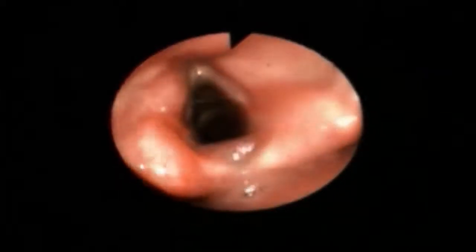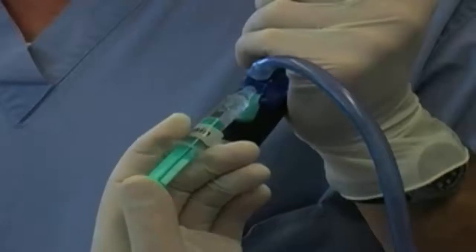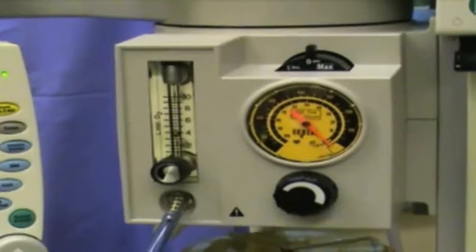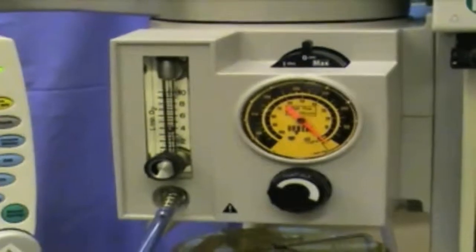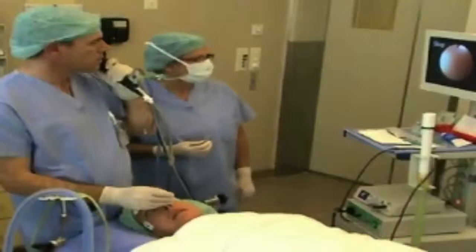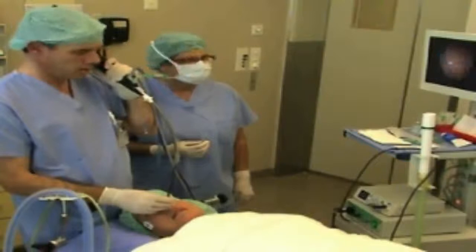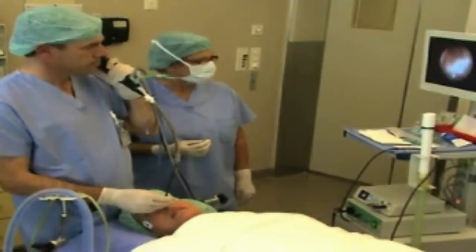At the supraglottic region, introduce 1 to 2 milliliters of local anesthetic through the working channel of the fibroscope while administering oxygen to propel the anesthetic into the area. Advance the fibroscope posterior to the epiglottis and through the vocal cords, taking care to avoid any direct contact with the pharyngeal and laryngeal structures. You can facilitate the advancement through the glottis by making a slight downward movement with the tip of the fibroscope.